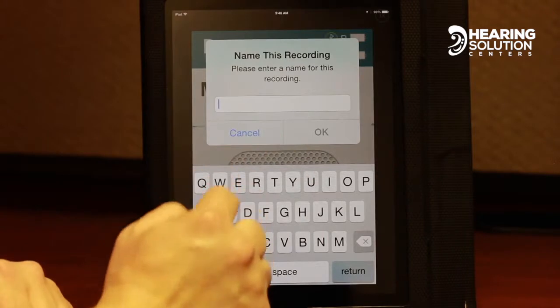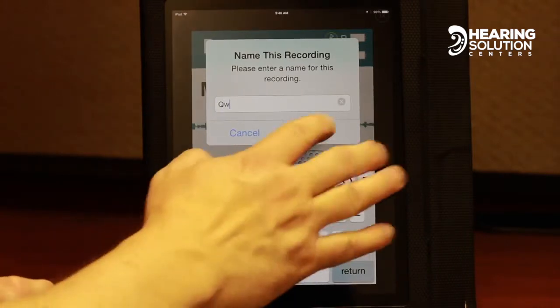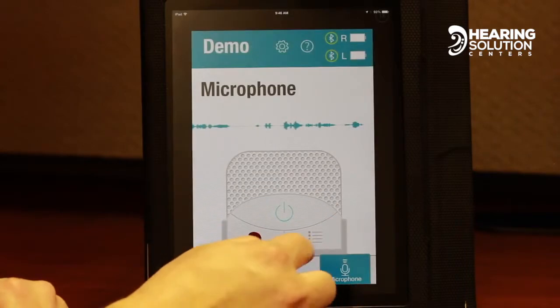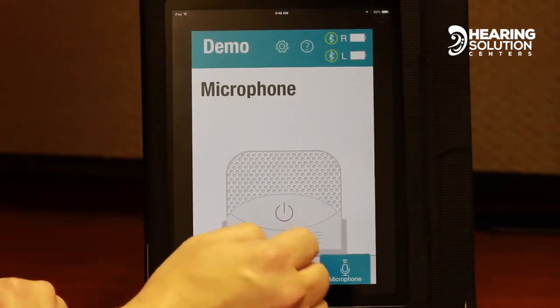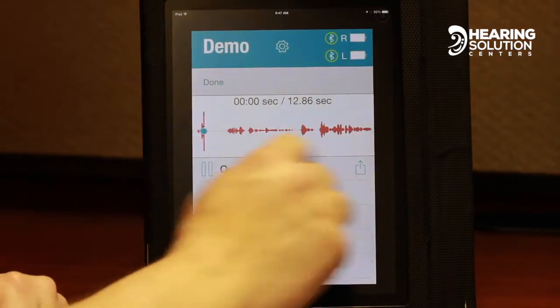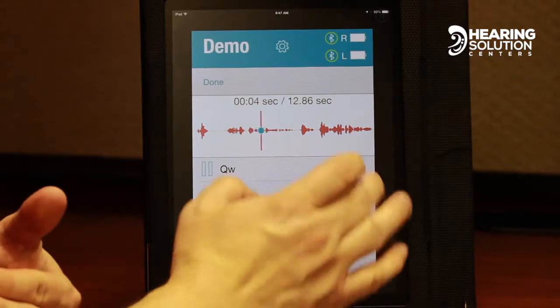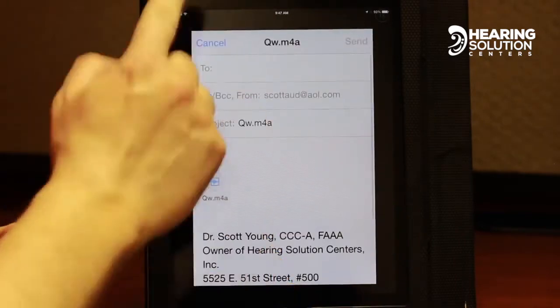Here's a recording now — it's read out on screen. We stop the recording and we can label it, say, the house. Then they could take that sound and play it for me in the office, or they could say, I just want to email it to them. So I'm going to email it. It's really cool.